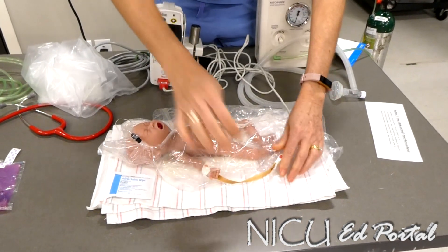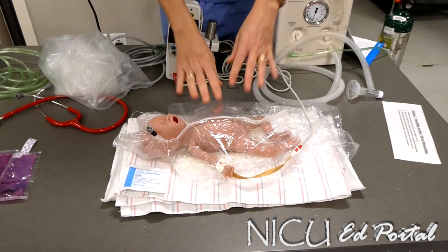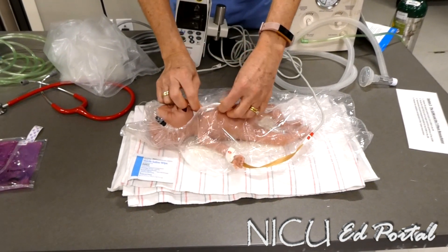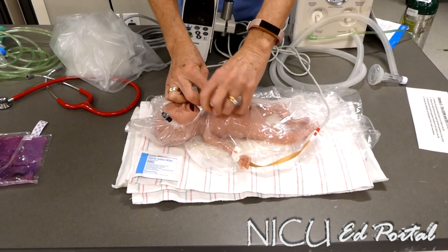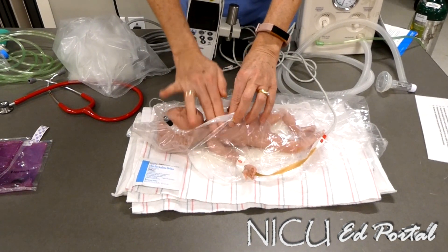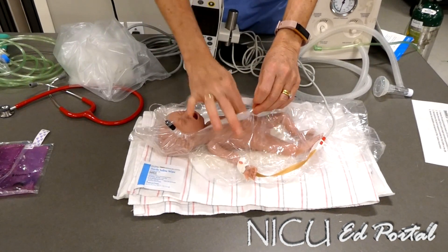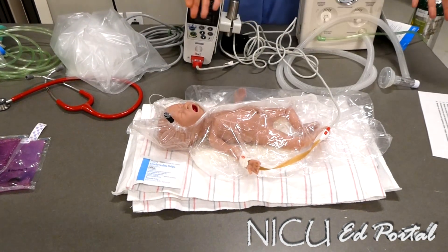If we have to resuscitate this baby and he needs cardiac leads, we're going to have to open up the bag. What we try to do is minimize the surface area that we leave exposed so the baby isn't dropping heat. I'll use warm saline to clean off three spots for my cardiac leads — one, two, and three — then close the bag back up again with the leads out to connect.